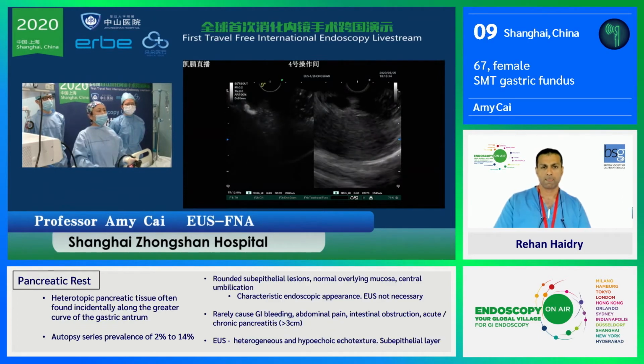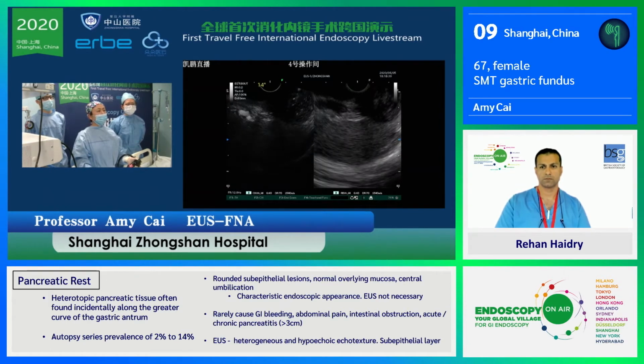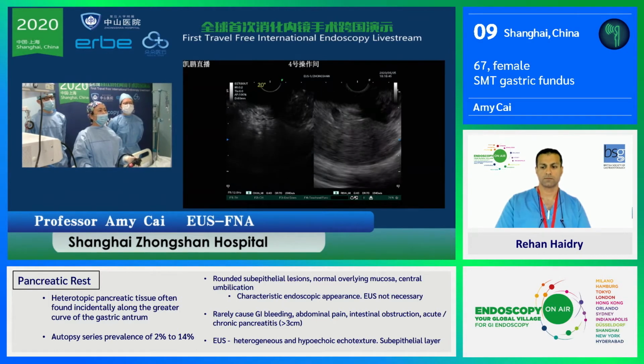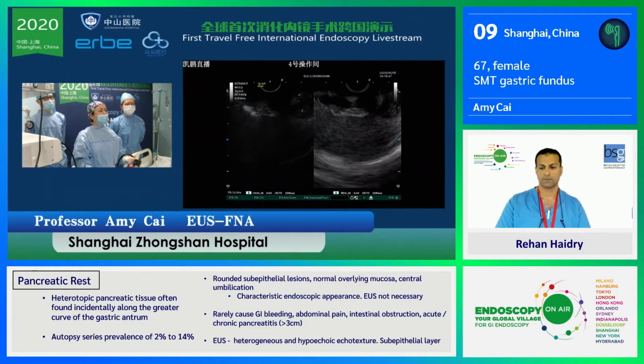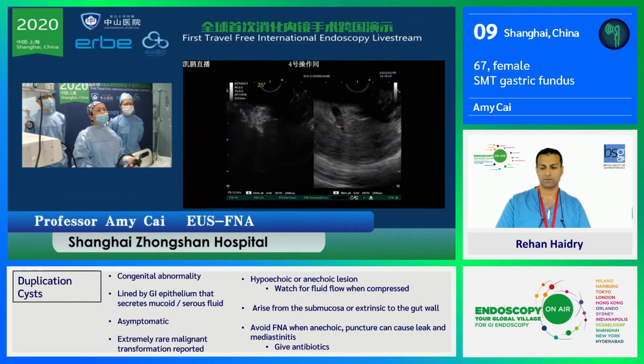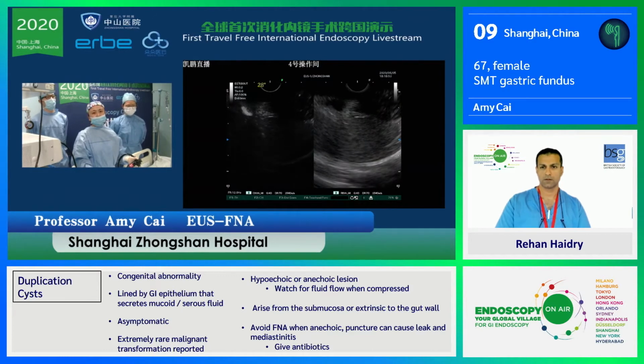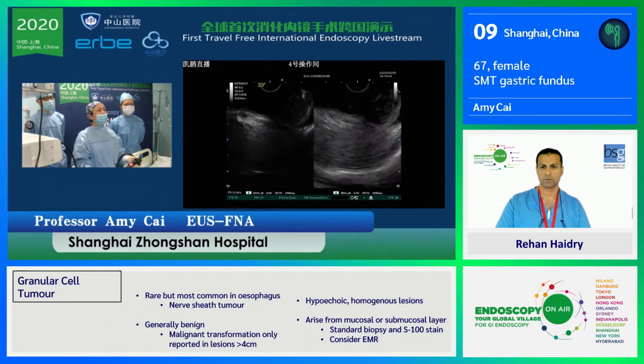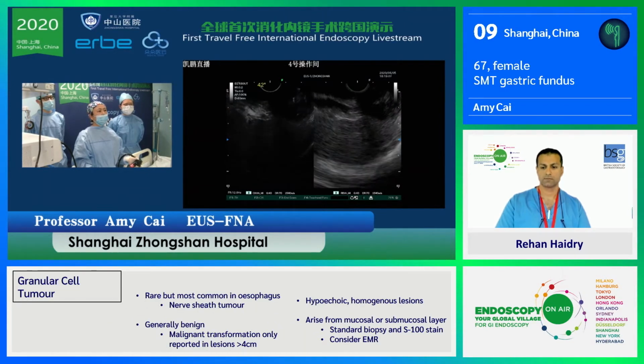Now we start the timer. The right side is the original B mode, and the left side is the contrast enhancement EUS. So you can see now it's 14 seconds after injection of the Sonovue. We can see there's hypervascularity of this lesion. Usually within 30 seconds is the early arterial phase, and then the later 40 to 120 seconds is the perfusion image. So now we have already identified that there's a lot of intratumoral vessel supply in this tumor. So it's suggesting maybe it's GIST.